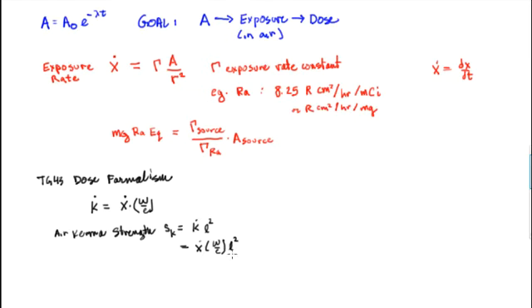And these are just numbers. And you can calculate this out, the W over E number and the L, which is defined as a meter. And when you multiply those numbers out, you end up getting the exposure rate in air times this number, 0.876. So the exposure rate is in Roentgens per hour, and this factor is the conversion of centigray per Roentgen at 1 meter in air.